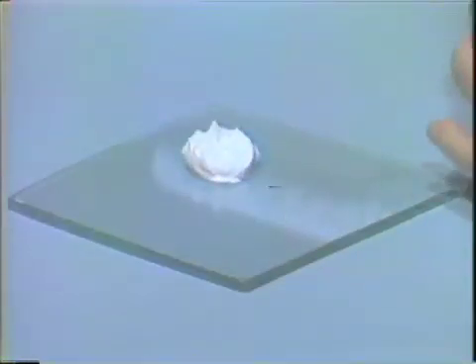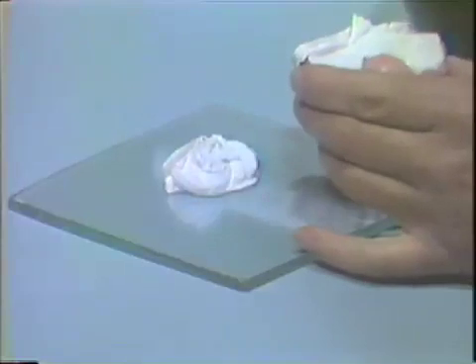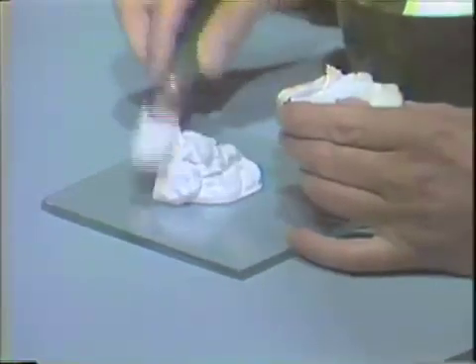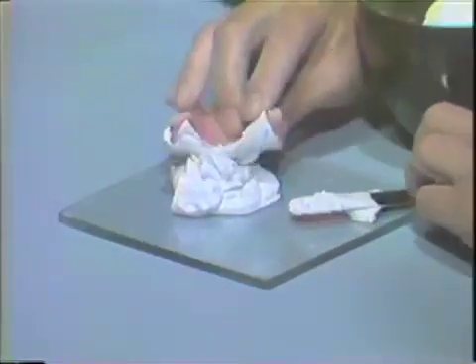Place the remaining impression plaster on a glass slab. Carefully settle the denture into the plaster.